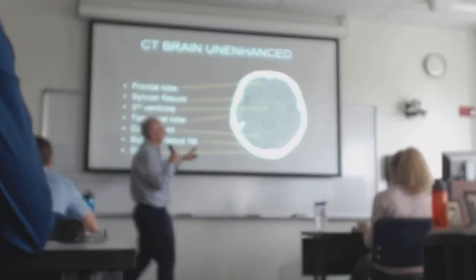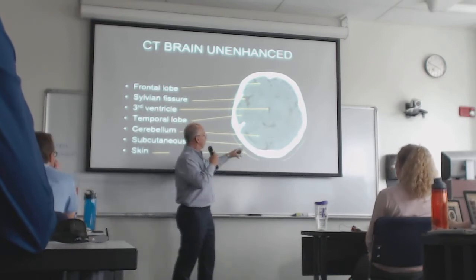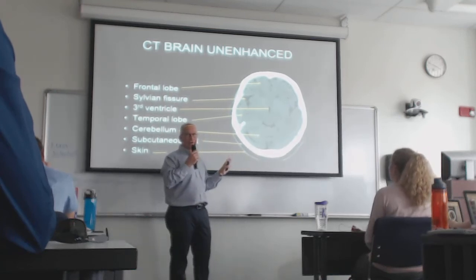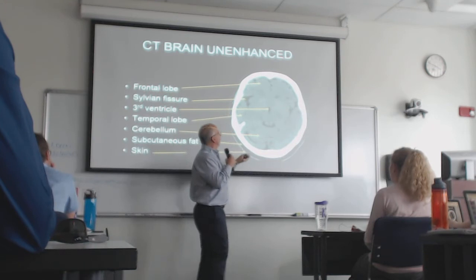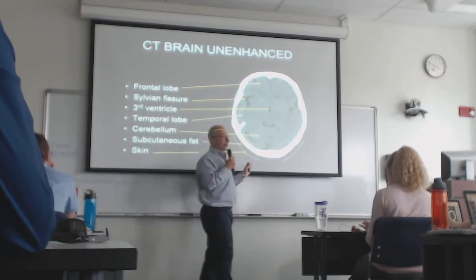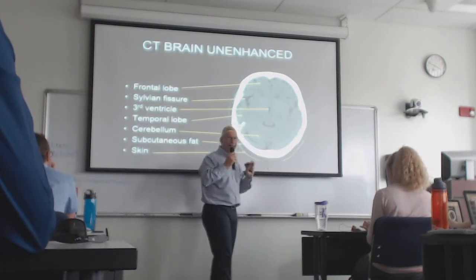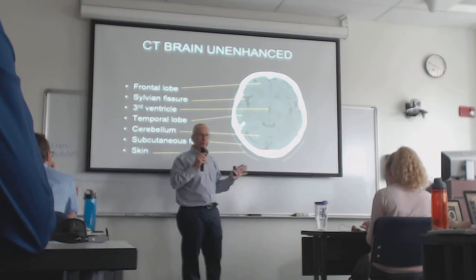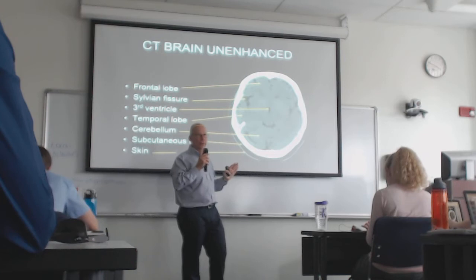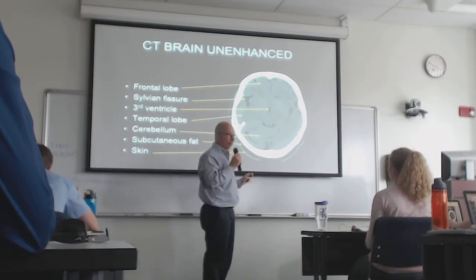Going higher still. Now I'm pretty much out of that area where the bone is so super dense. The skull is dense, but it's not causing me any real artifact problems at this point. And now I'm really loving symmetry. I want everything to be the same from one side to the other. The brain is absolutely symmetric when it's normal. As far as imaging is concerned, it is symmetric. You want to see symmetry. If you see symmetry, chances are you're dealing with a perfectly normal brain.